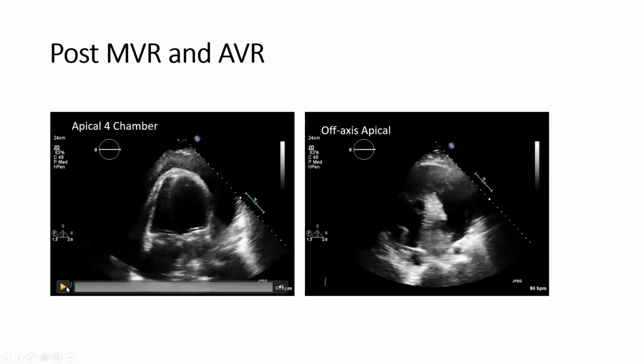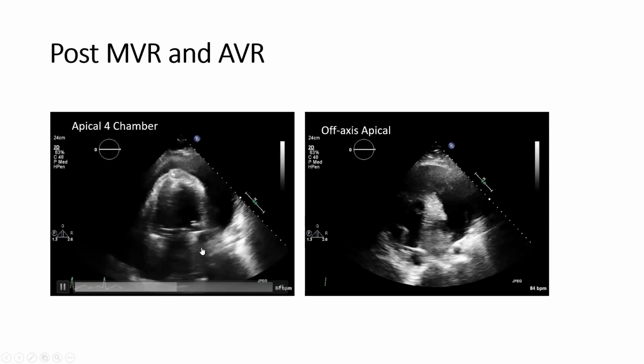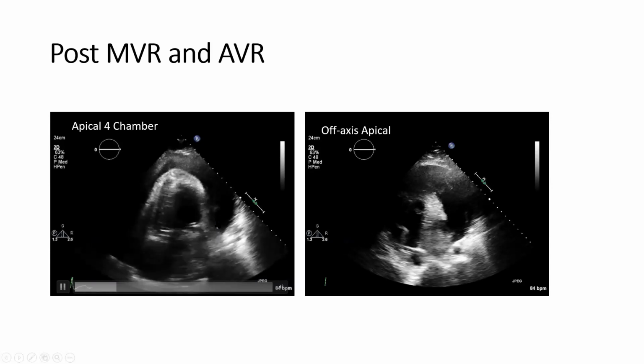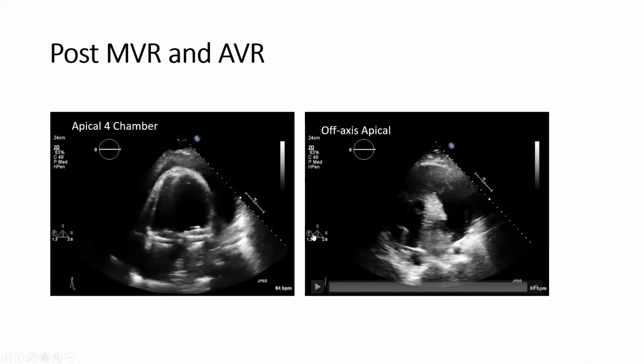So this is the same patient's apical 4-chamber view. You can see the prosthetic valve, that there is a mitral prosthetic valve, there is a large pericardial effusion, and see the way it ends at the mitral left ventricular AV groove level, because there is truly no pericardial space outside the left atrium.